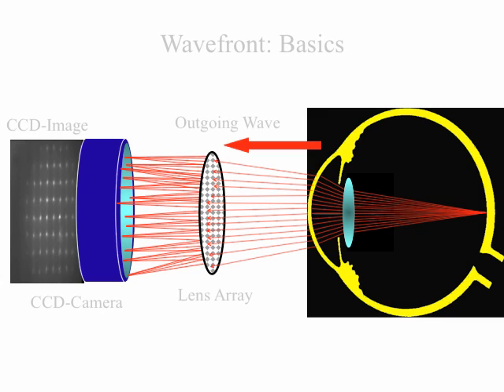We're then going to introduce in front of the eye a little cardboard disc, an opaque cardboard disc. And into this cardboard disc, we're going to perforate little holes. And we're going to make the holes in a grid pattern, and they're going to be absolutely perfectly equally spaced. Now, let's say that they're spaced out so that the holes are separated by 1 millimeter. In actual fact, we'd of course make them much more closely spaced than this. But let's say that they're exactly spaced by 1 millimeter.